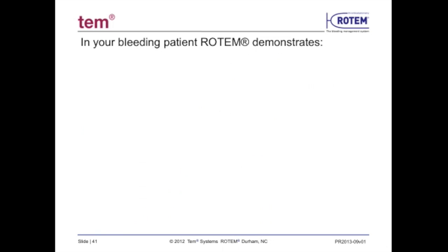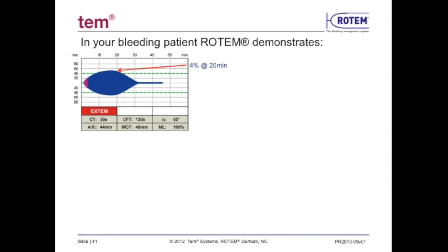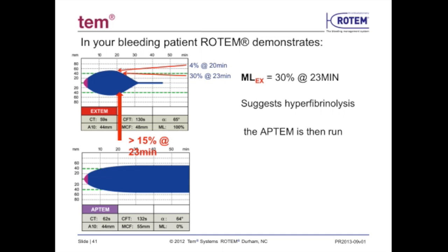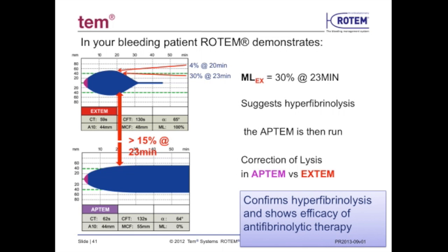In this example, the patient is bleeding because the clot is not sustainable. After about 20 minutes, there is evidence of early clot lysis — the ML at 20 minutes is about 4% and at 23 minutes it is 30%. A 15% or greater ML value is a positive indicator for hyperfibrinolysis. When the Aptem test is run, the hyperfibrinolysis is corrected in the sample, indicating how the patient will respond to anti-fibrinolytic therapy and whether additional transfusion therapy might be required.